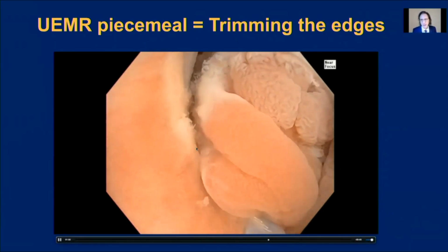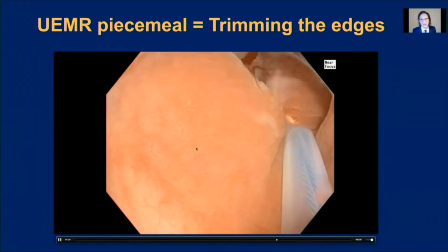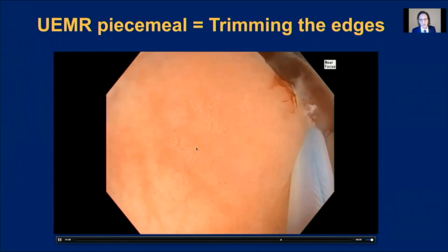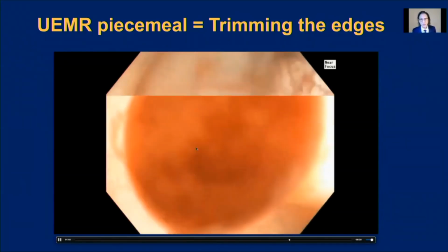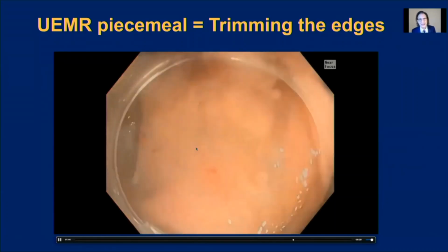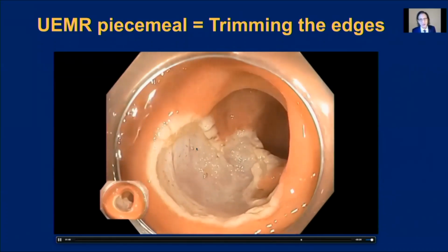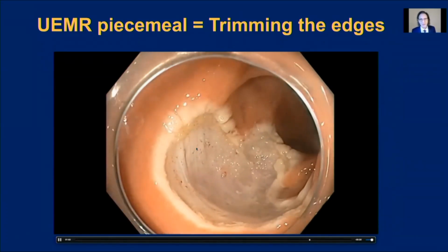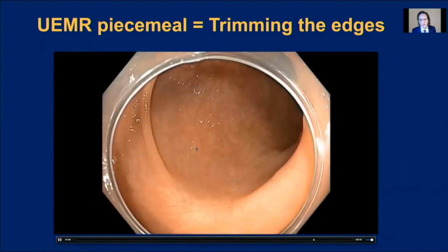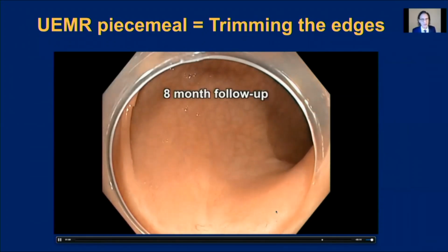And I will usually use a smaller snare for the trimming part because it's not necessary to use such a large snare. It's easier. So what we do is always place the edge of the snare at the edge of the prior resection. So here you can see that with 2 pieces, we were able to get the entire lesion out. And this is the appearance at 8 months with scar tissue.